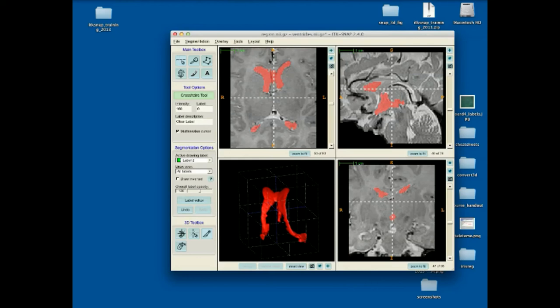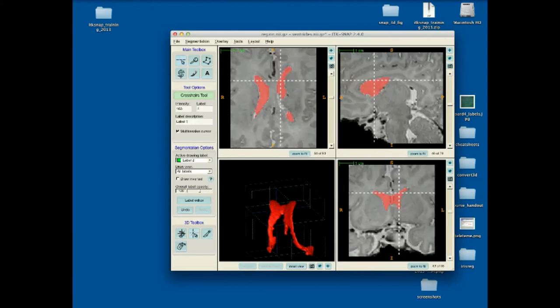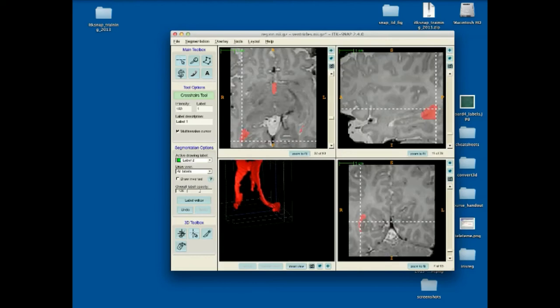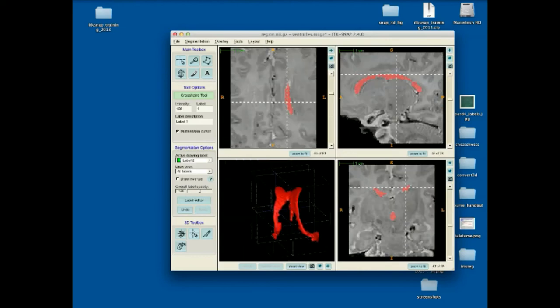Just a couple of questions came up with the 3D tools as I was walking around. I was asked, what does this second button do here? This button is for positioning your cursor wherever you click on the mesh. So your 3D cursor, you can click different places on the mesh, and your cursor gets positioned there.